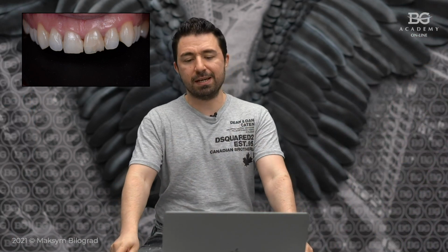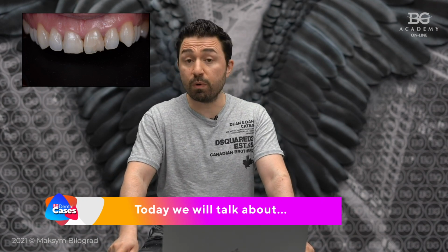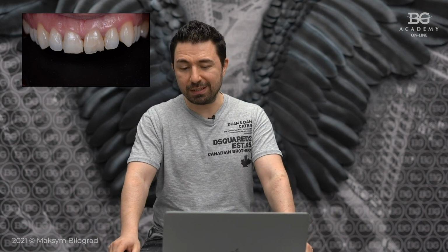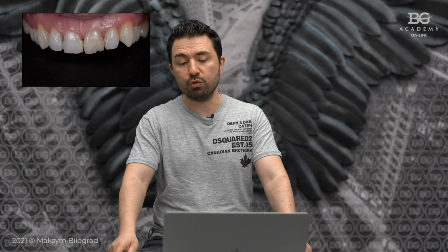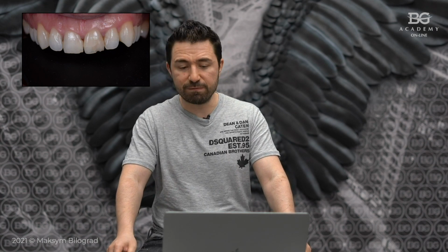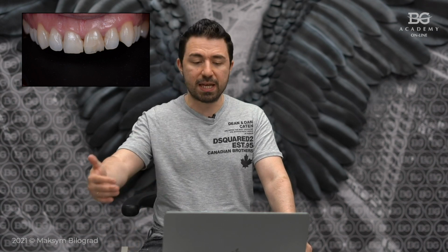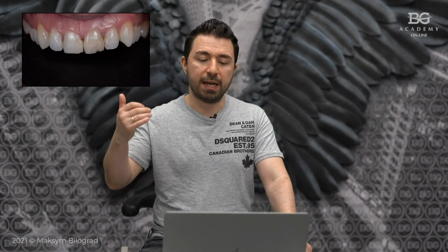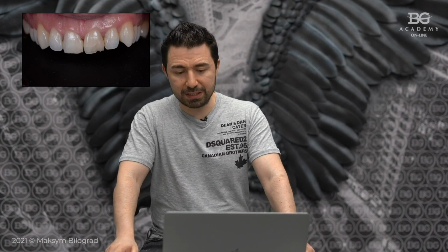Hello dear friends, we are back with the BG Dental cases, and this time will be a very interesting and controversial clinical case of aesthetic rehabilitation with porcelain veneers in a situation when the patient actually needed orthodontic treatment, and I was trying to convince this patient to switch to the orthodontic treatment first, but the patient refused. And I will share with you step by step how I resolved the case and how I planned it, and what kind of tips and tricks I used to make this case more or less conservative.